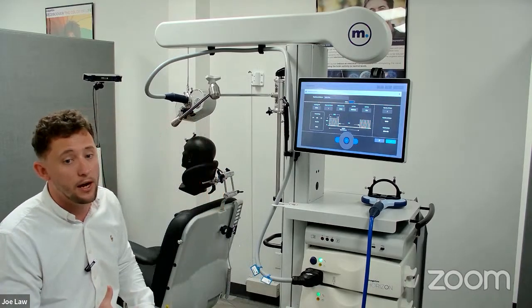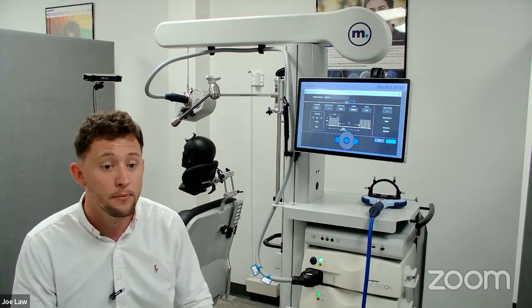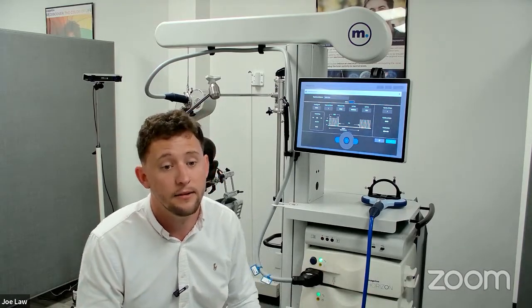But there is no process needed for measuring the output of the coil. If you are concerned about that and it's something you really want to get tested, you can always send this back to our service center and we can measure that for you. But the way the system works, it's not required.